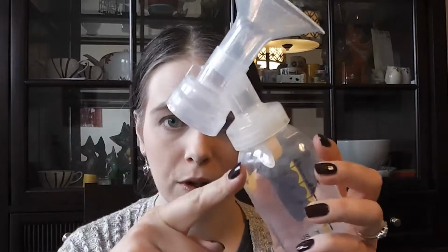So I will take 2 of these in the bag with me to work. The ones they sent me with my pump have this piece that comes off like that. I guess they're easier to clean, and that's a perk. I did buy an extra supply kit for my pump, which came with 2 more of these with the whole assembly, except that this part doesn't come apart. It's all one piece that's connected. I prefer those for work because I'm always scared that this is going to pop off, and that would be really bad if it did that while you were pumping at work. You could potentially get milk on your clothes, and that would be really awkward.